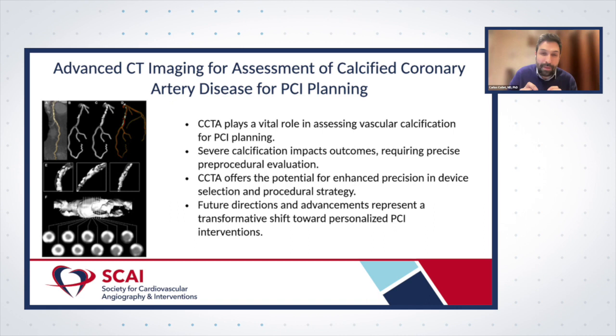And this is a capability only from CT, in terms of having a stratification of how hard or soft the calcium is. And I think this is going to be the future in terms of PCI planning, advanced calcium modification, device selection, etc.